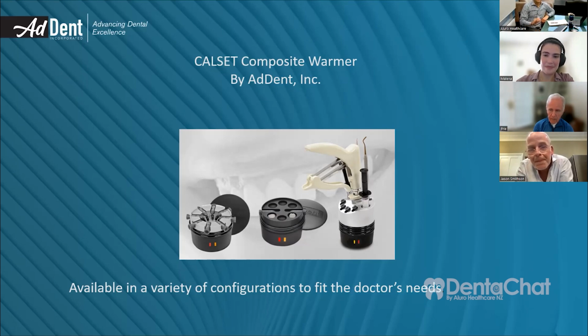Thank you so much, Jason, for joining us. As a little aside, even if you're not heating the resin and you're using a regular veneer cement, that veneer tray is actually quite useful. It saves you spreading things all over your tray table. So it's quite a neat bit of kit, full stop.